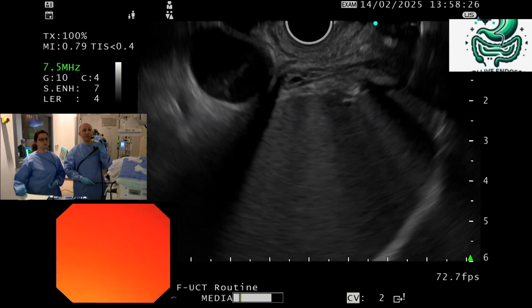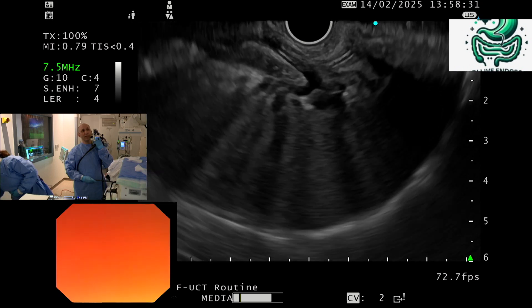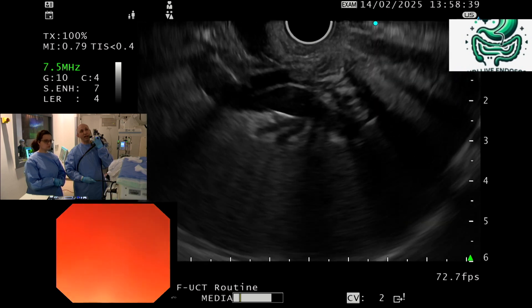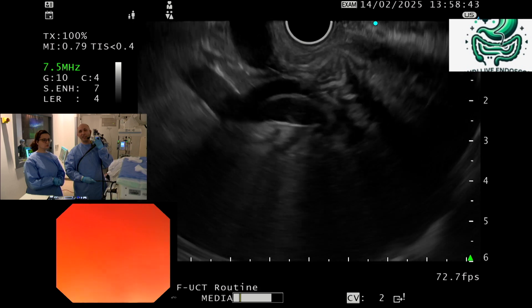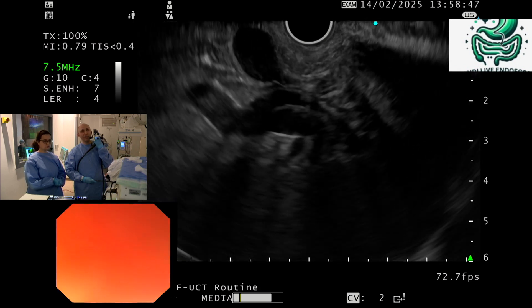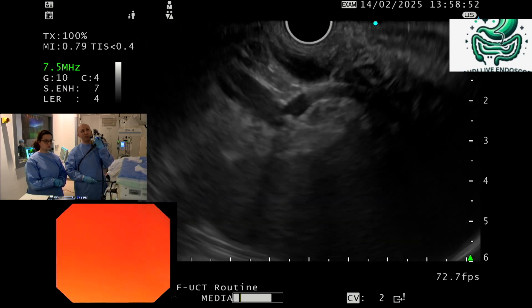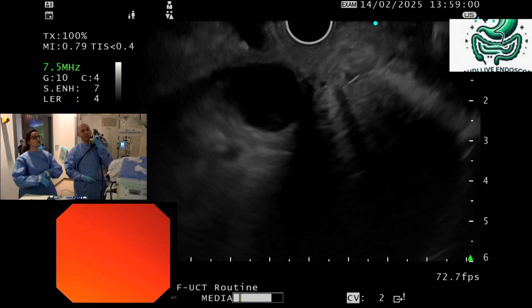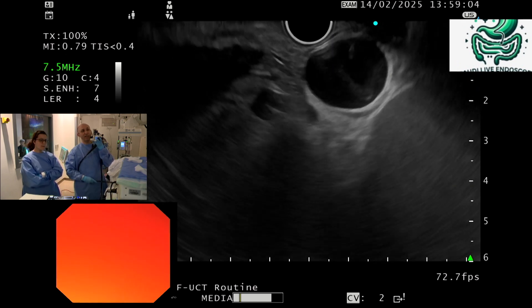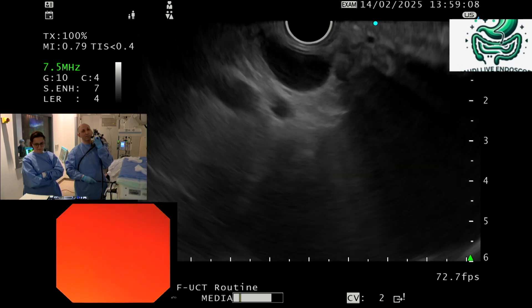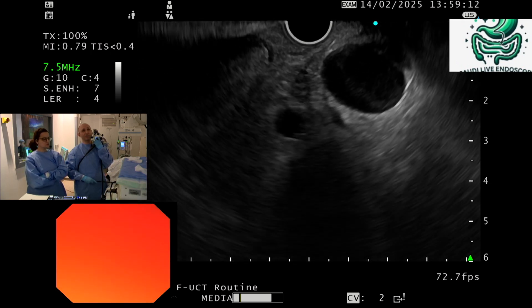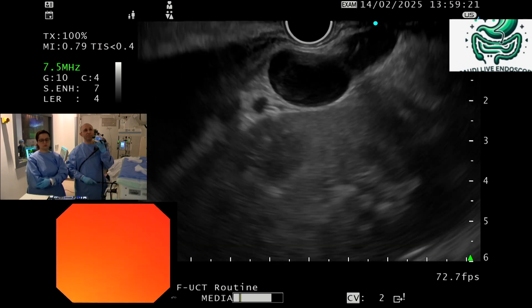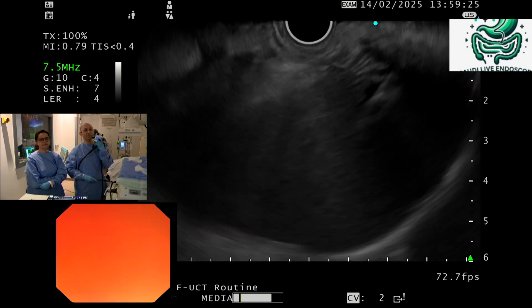Regarding the second point: this is the spleen, and this is the splenic hilum, close to the pancreatic tail. This position is a little unstable because the cyst is pushing the scope. I'll try to check the pancreatic tail — now we are close to it. You can see the cyst and its relation; when I push it disappears and reappears. Do you think it's related to the pancreatic body or outside? It looks like it's outside. I agree with the duplication cyst — we can see two layers in one of the views, like the upper border showing two layers. So it appears to be a gastric duplication cyst arising from the external surface of the stomach.